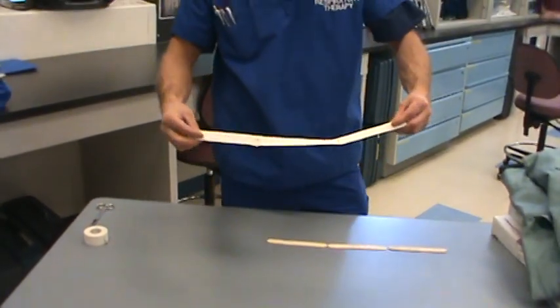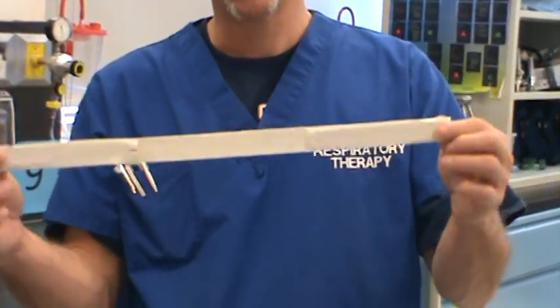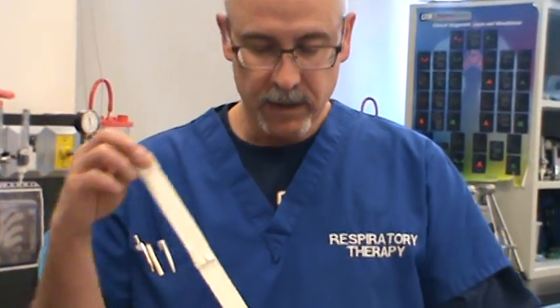There we have it. One complete set of tapes ready to go. You probably would want to make a few sets of tapes when you're practicing your intubations, just so you have enough sets to secure the tube with, because until you get really good at it, you might muddle this step up and have to retape and retape until you get the technique good. All right, and that's the end of the building the tape section.